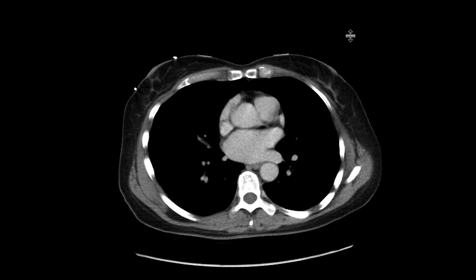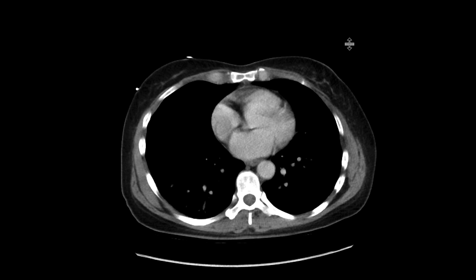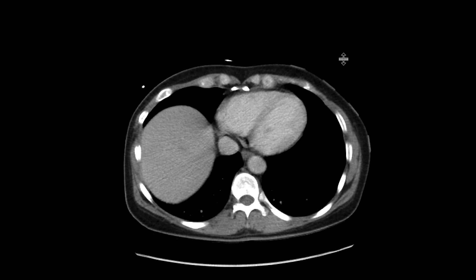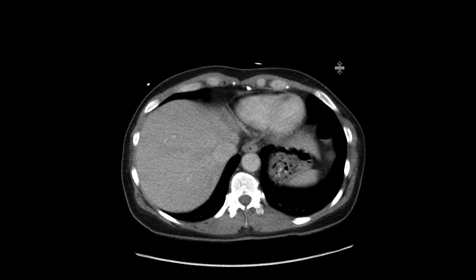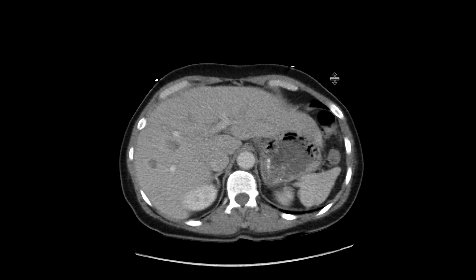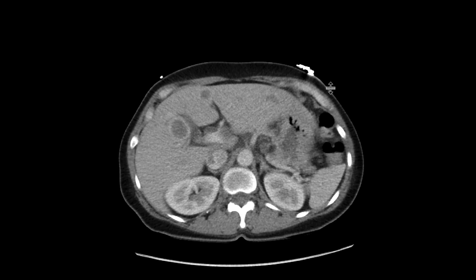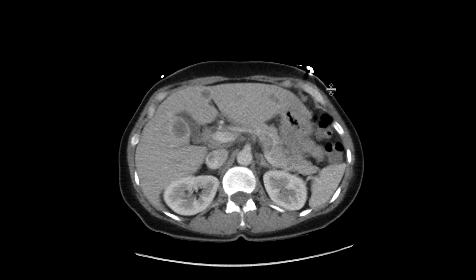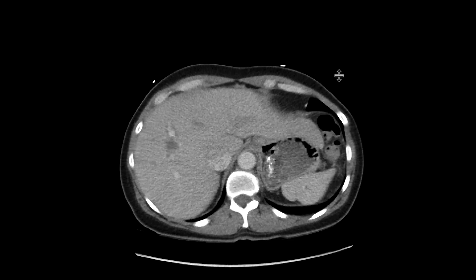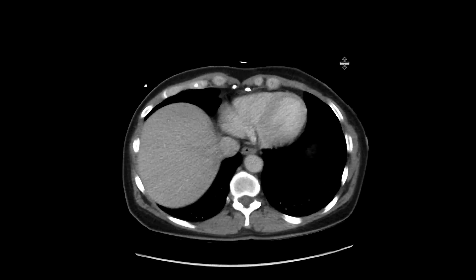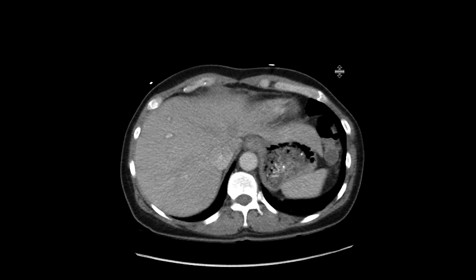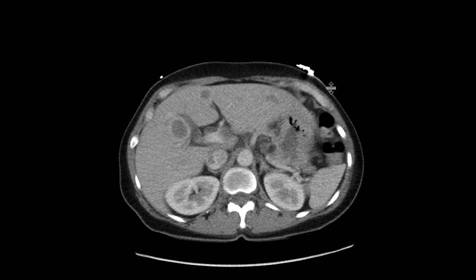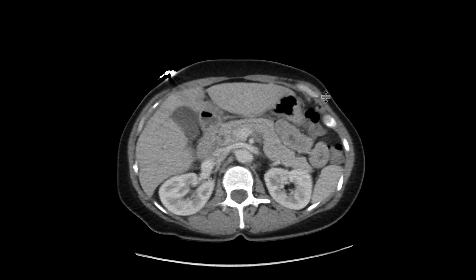This is a 50-year-old patient who came with left lower quadrant pain. As we scroll down in this patient, you can start to see that there are abnormalities in the liver — several multifocal liver masses, and they don't look readily benign. They don't look like cysts, and they don't really look like hemangiomas.